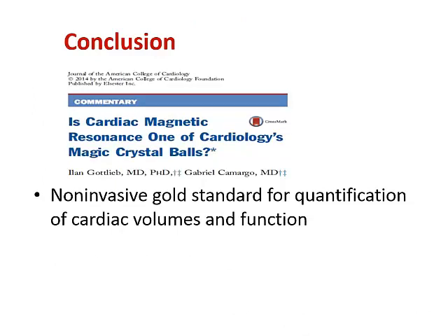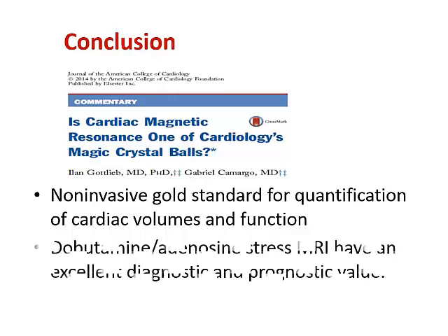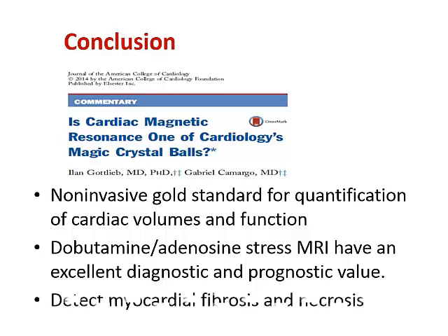It is the gold standard for quantification of LV ejection fraction and volumes. The dobutamine and adenosine diagnostic performance is excellent. We have excellent prognostic value, and using MRI we are able to perform tissue characterization. Thank you.